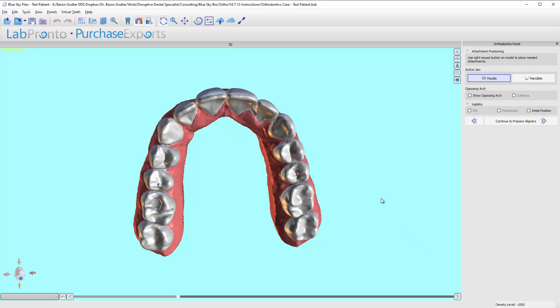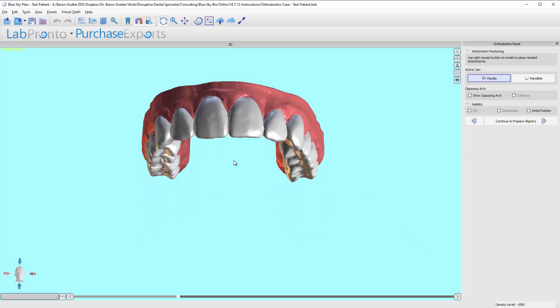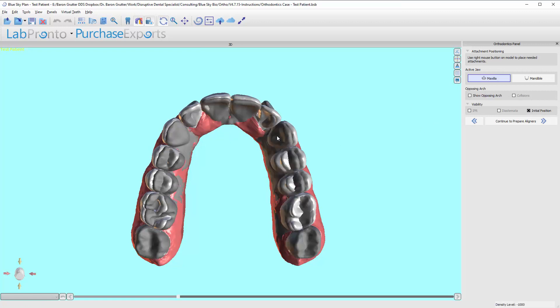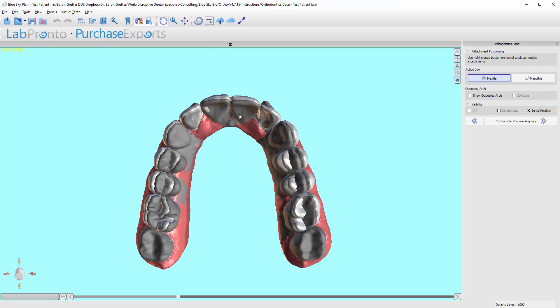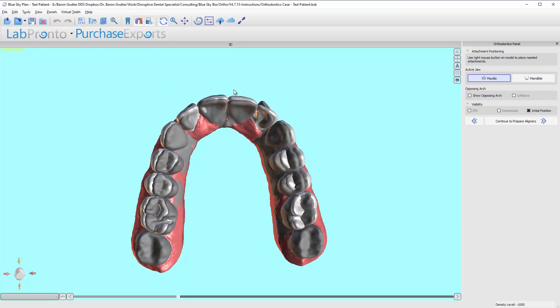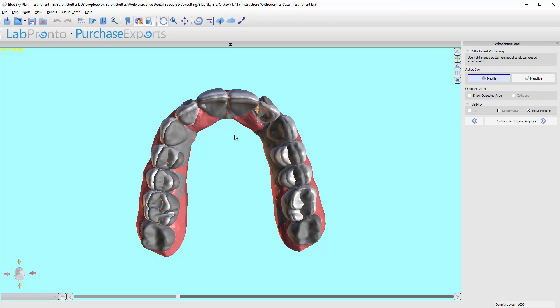Okay, so we are now in the adding buttons phase. Now how I like to add buttons is I like to turn on the initial position so I can see how teeth were originally positioned because this gives me an idea of where we're trying to go.